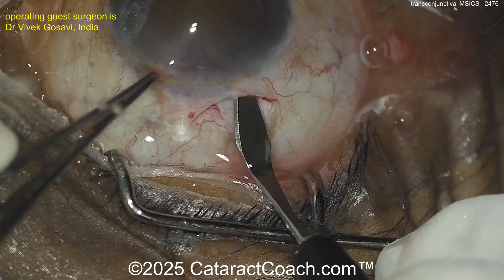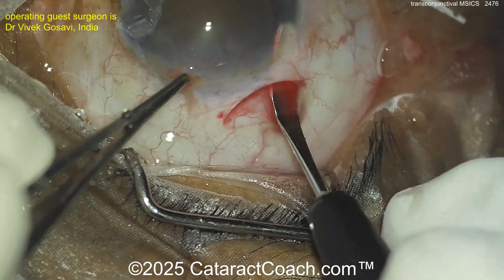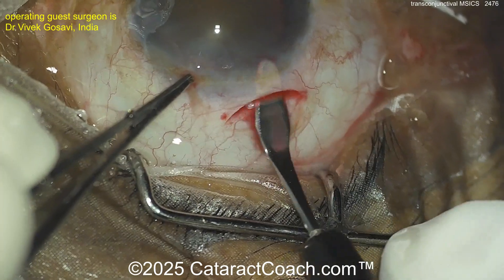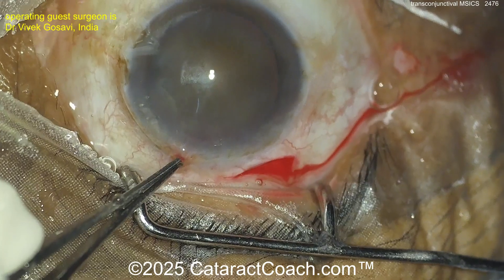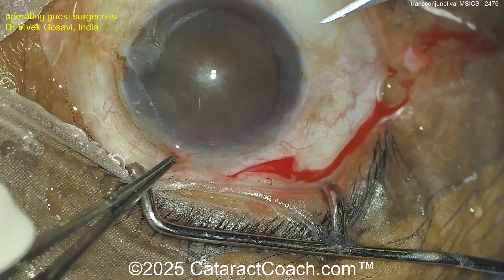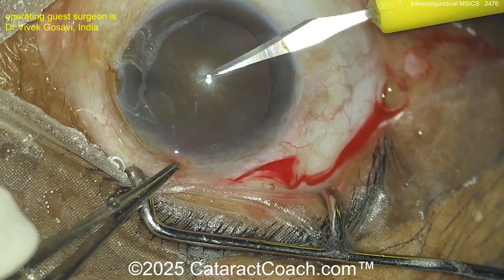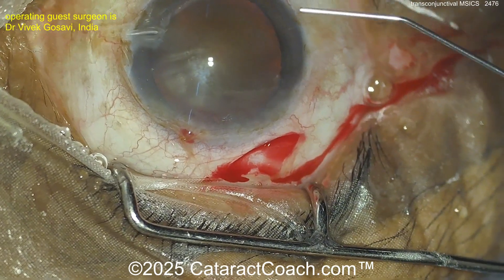Here you go — a long tunnel length, nicely made. There are surgeons like this who have a lot more MSICS experience than I do. Because of my location, I mostly do phaco — my MSICS procedures are at most one, maybe two in a month, whereas I'll do a hundred times that for cataracts. Now making another paracentesis — there it is, that's another incision.